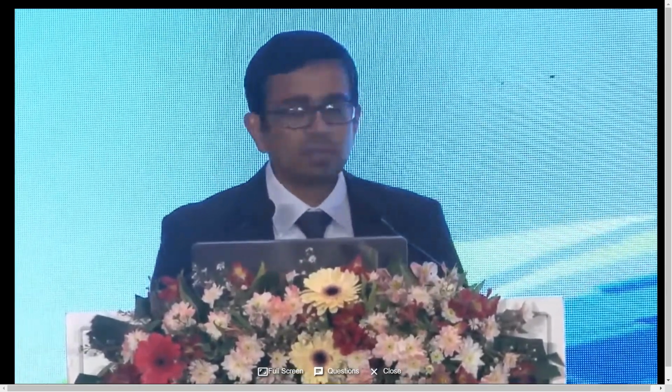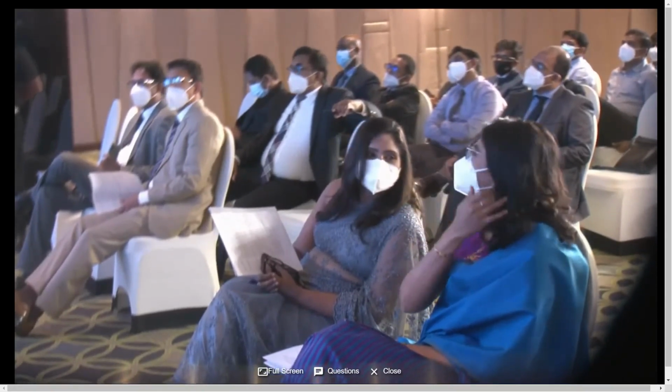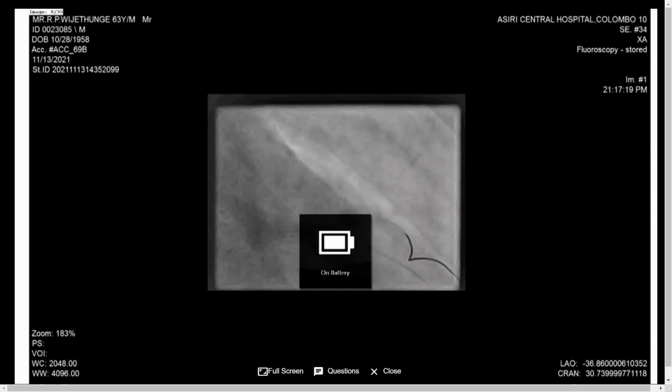Then comes the first kissing. Now this is going to be very important. First you crush the stent. Secondly you kiss the two stents. But the main vessel will have only a balloon of the diameter size, not a higher diameter balloon, so make sure that your stent will not dissect your vessel. Therefore your balloon opening is going to be equal to the diameter of the vessel, and you do the first kissing.